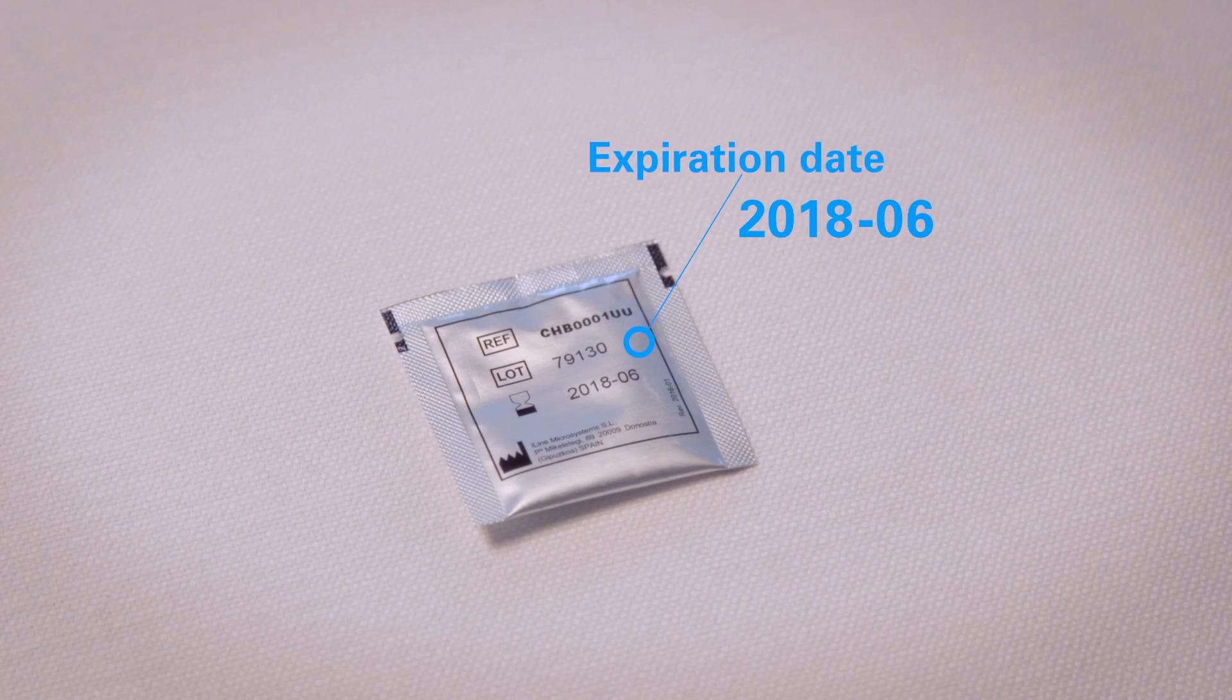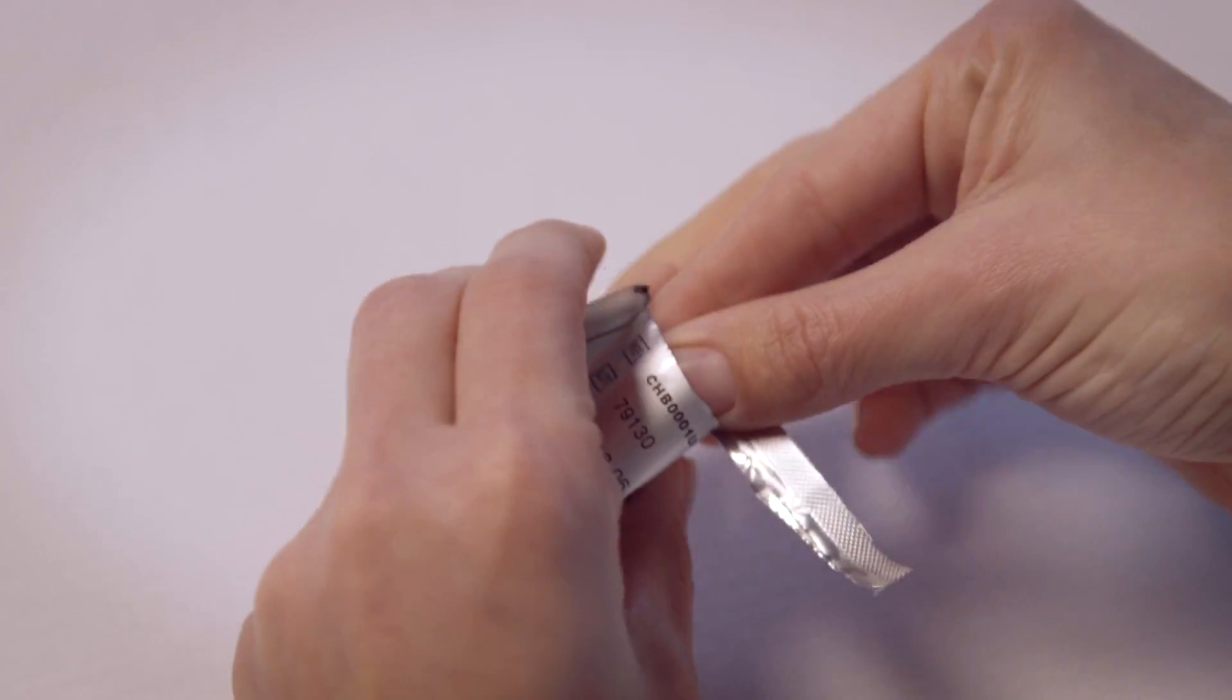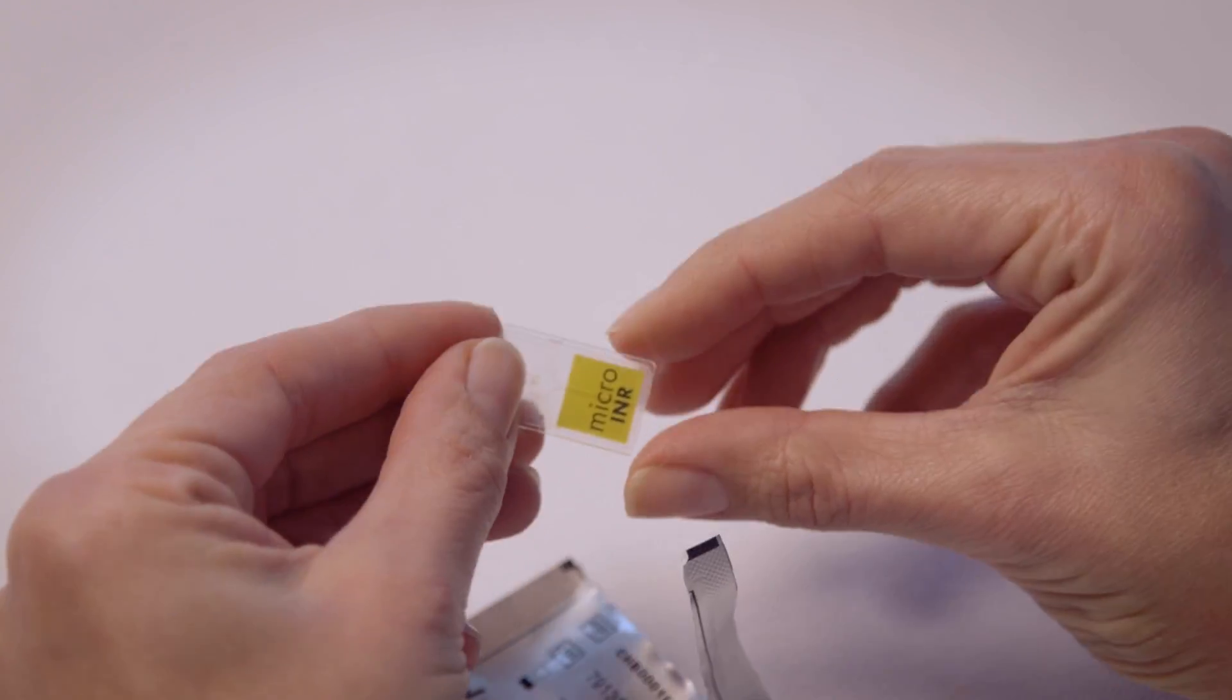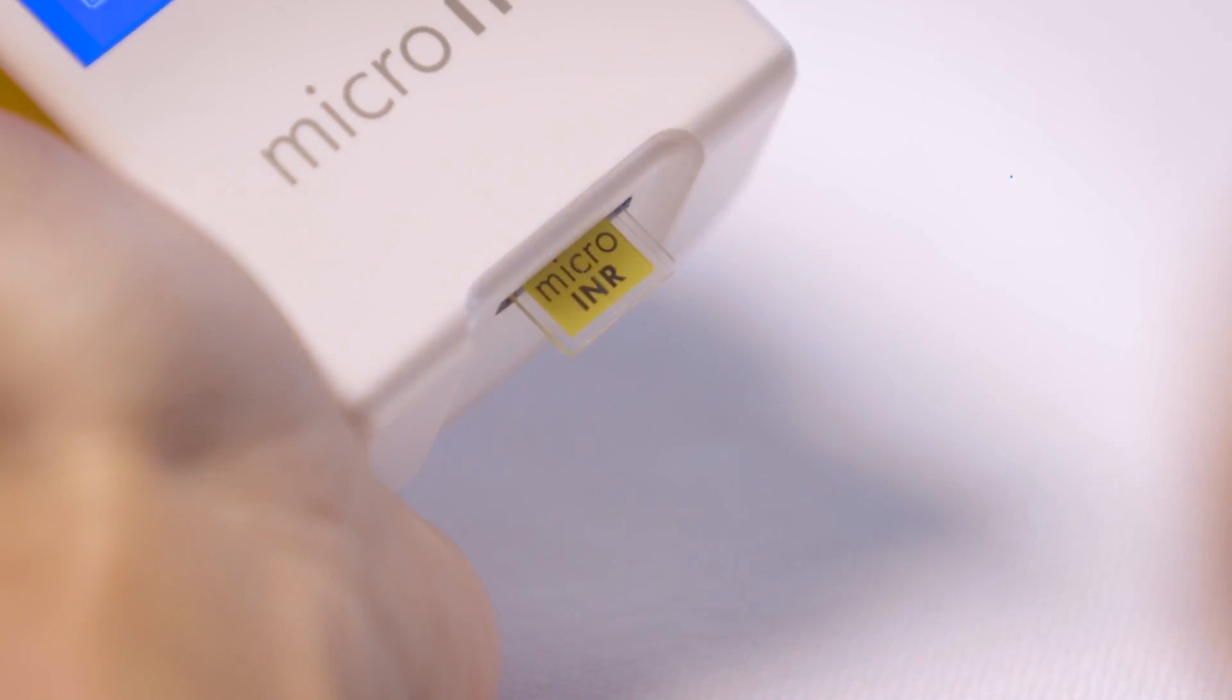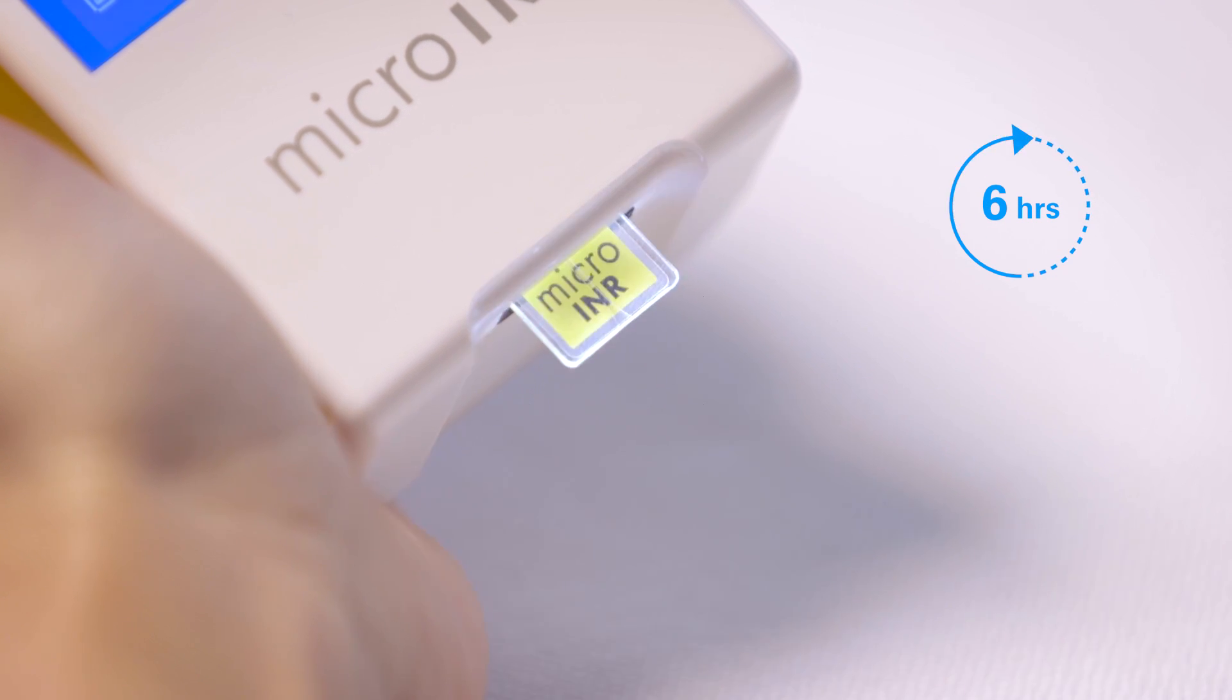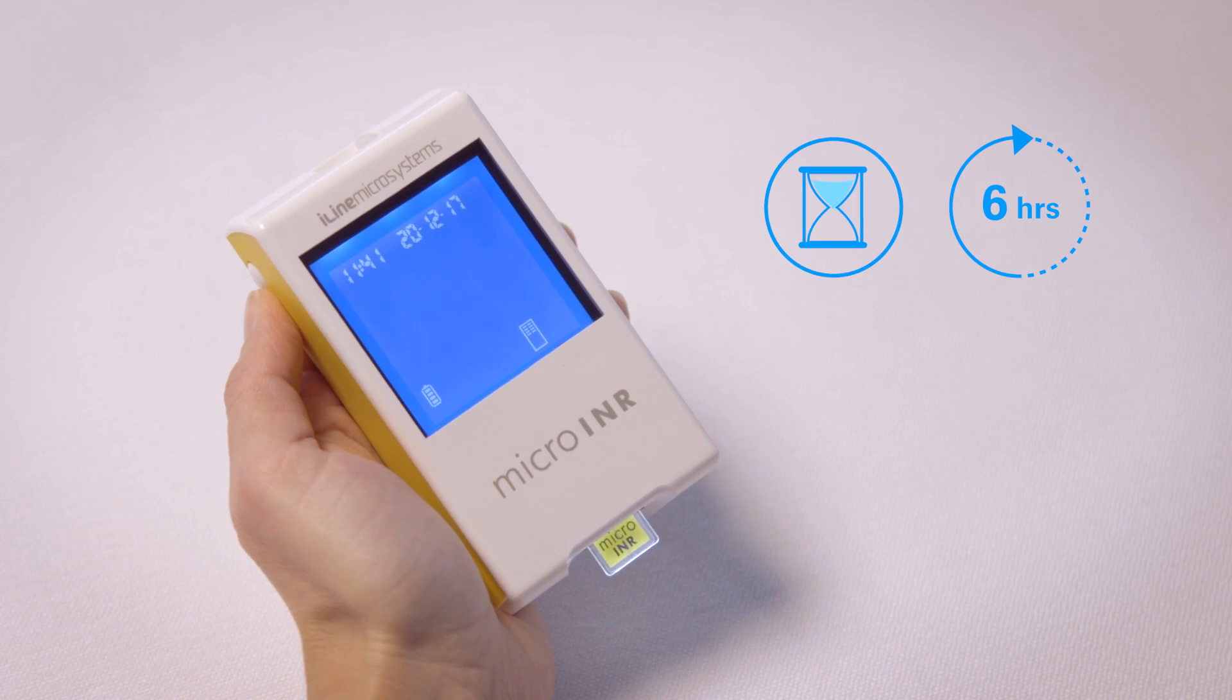Check the expiration date of the chip. Take the chip out of the pouch and insert the chip into the meter. The meter will automatically turn on. The chip needs to be used within six hours after opening the pouch. The meter warms up.